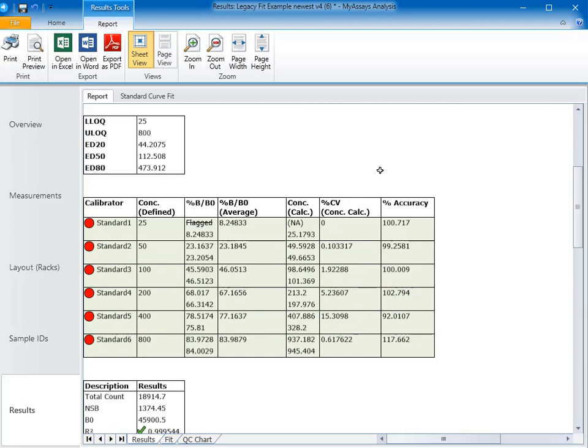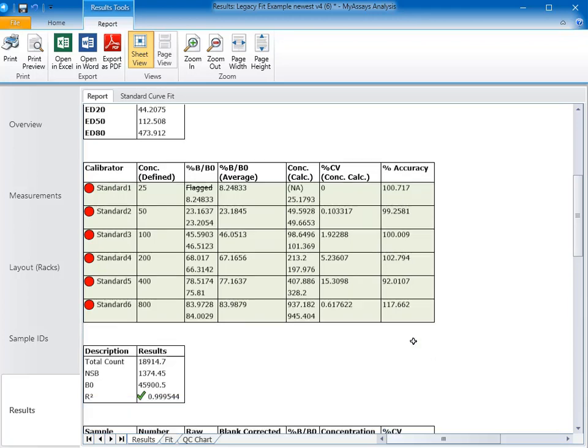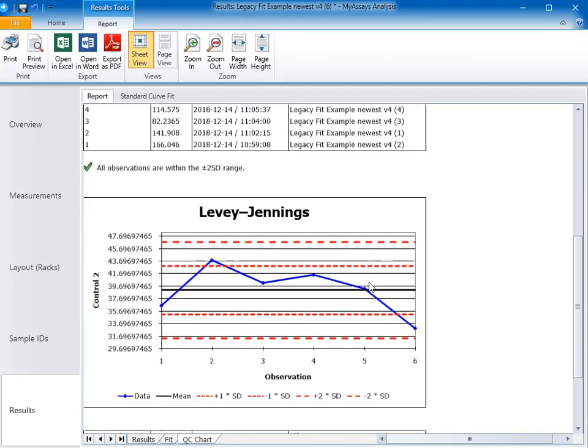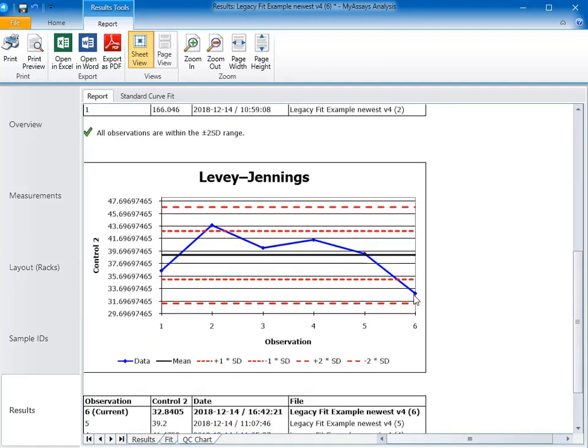You can see the curve data table now shows all standards highlighted in green. The percent CV for Standard 1 is now 0, because there's only a single replicate, and the new curve fit also greatly improves the accuracy from Standard 6. The R squared is also higher, and if we look at our QC chart, we can see that the value for control 2 is closer to the mean.